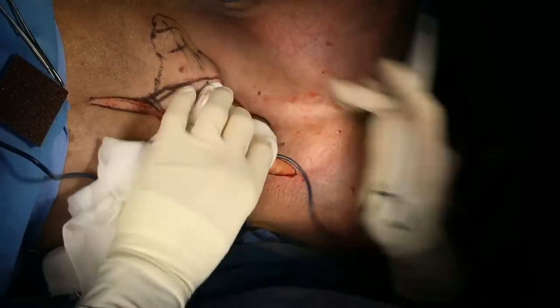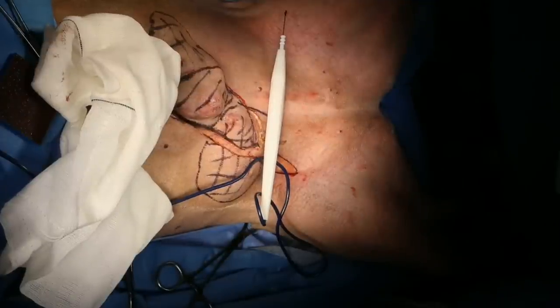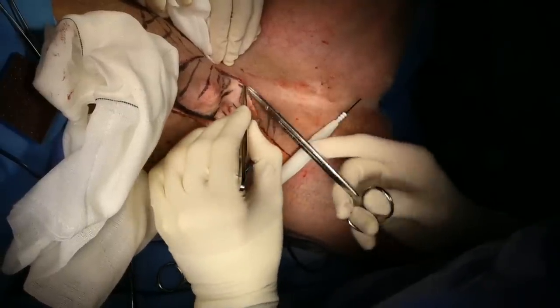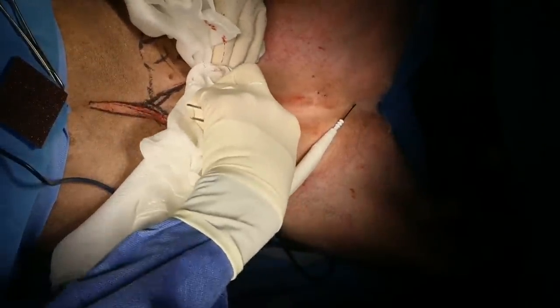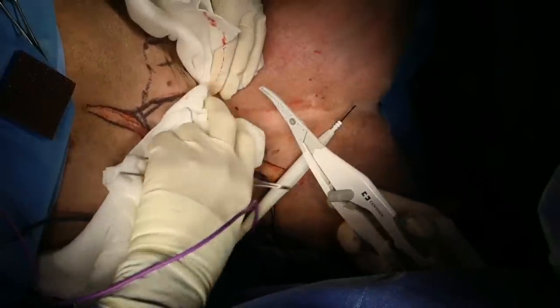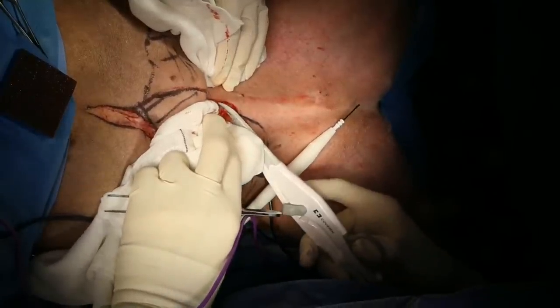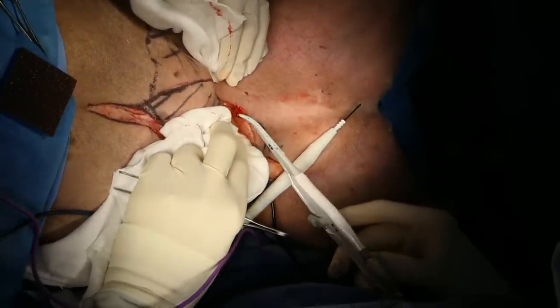Can I get an extra lap sponge for you to retract? Just retract on the skin there. So I'm just being very careful to make sure that I don't cut into the tumor with my skin incision. Now, again, the fact that this is a grade 1 tumor means that we are more able to preserve the skin. Now, I'm just getting into the caudal superficial epigastric vessel right there. Nearly got Mel. A little bit of spatter.